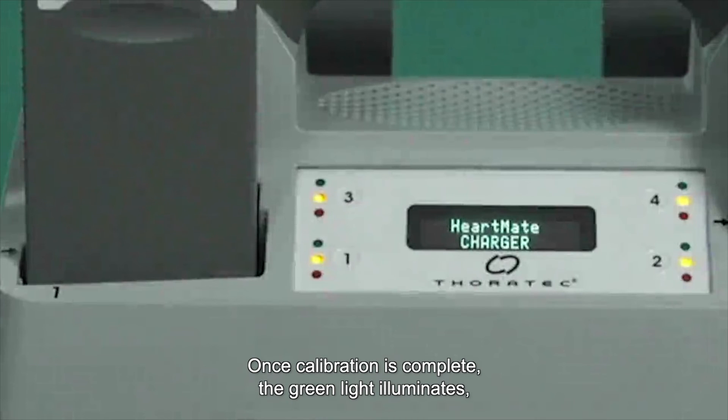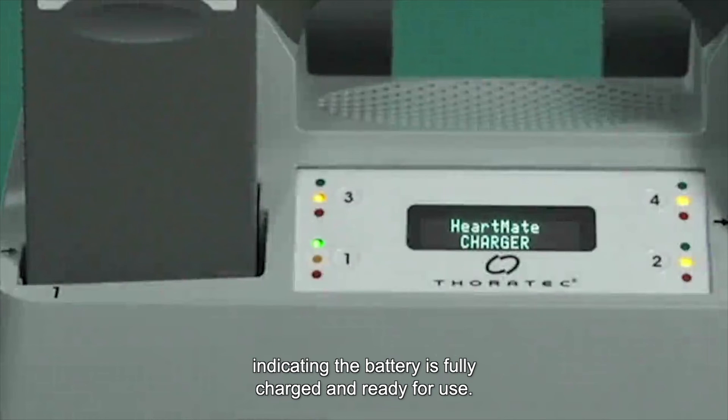Once calibration is complete, the green light illuminates indicating the battery is fully charged and ready for use.